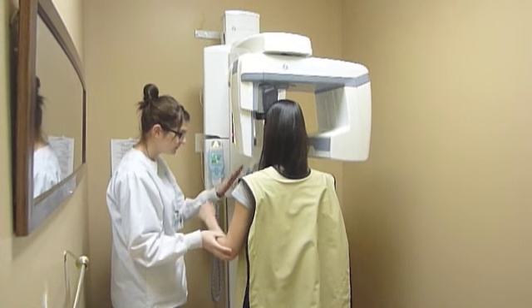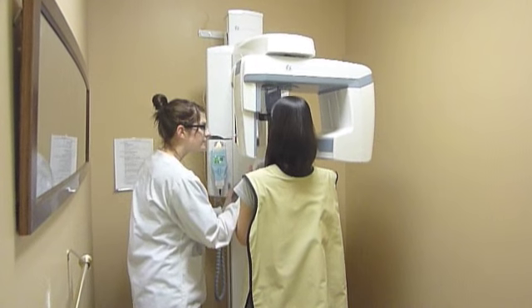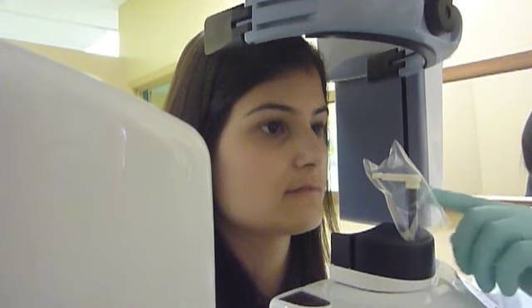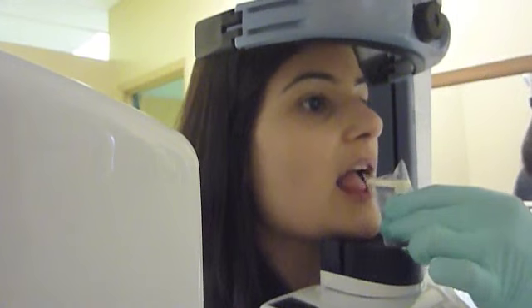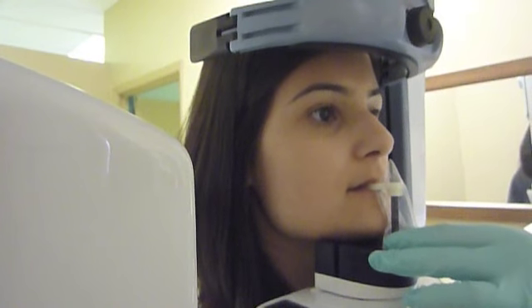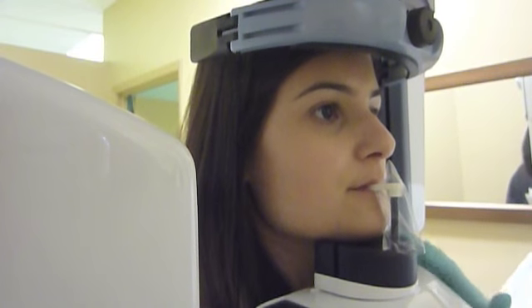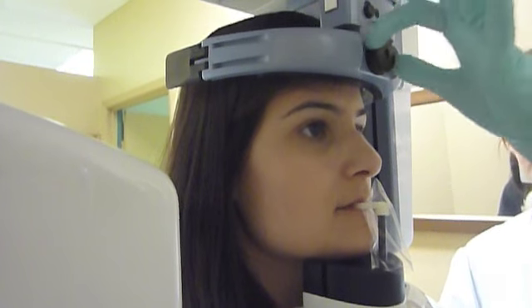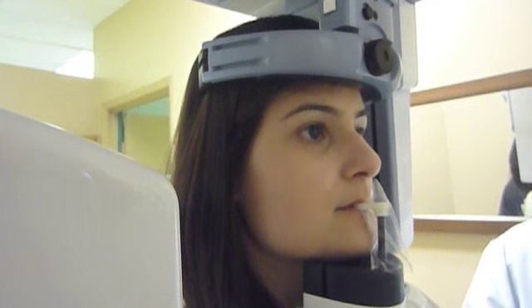Guide your client to the unit and instruct them to grip the handles. Have your client stand straight up and tall. Have your client place their chin on the chin rest. Next, have them bite down in the groove of the bite block with their anterior teeth end to end. Ensure the patient's head is parallel to the floor. Have the client move their forehead up to the head support and close the temple support using the black knob.